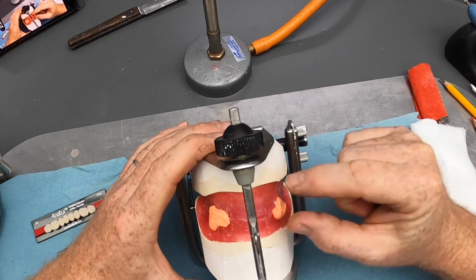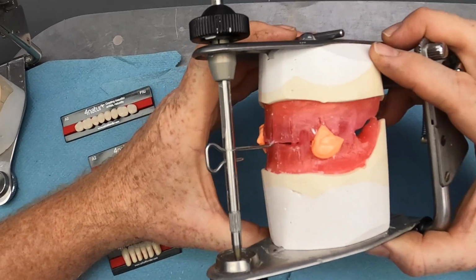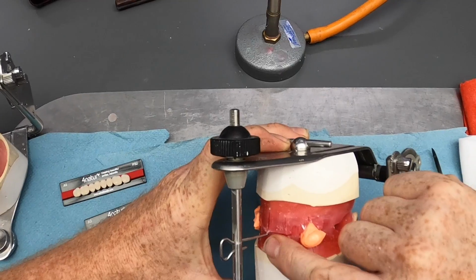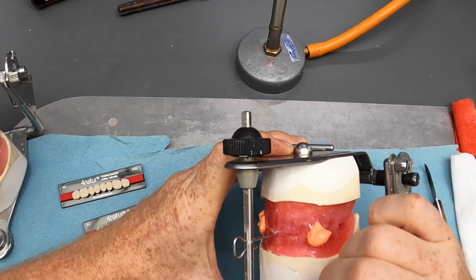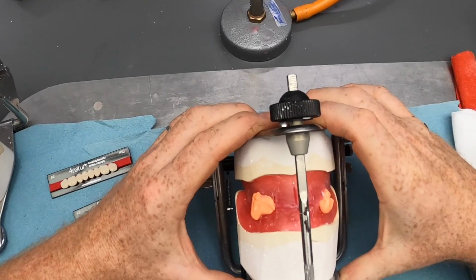We can just preserve the rims and keep them as a record, and if you're going to do that, then we can make little silicone indices here and set up to the indices, or we can use a flat plane to set up, or we can just set up straight into the wax registration rims. I'm going to do that today.